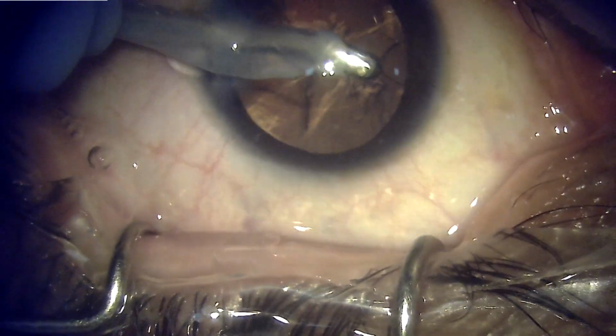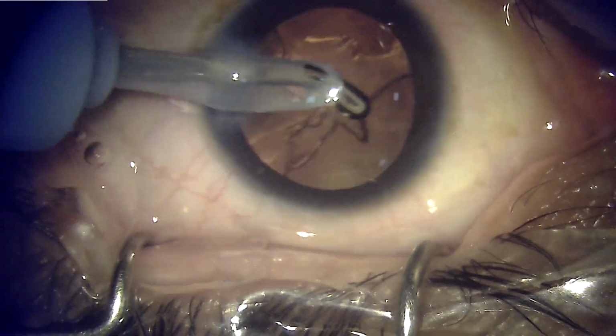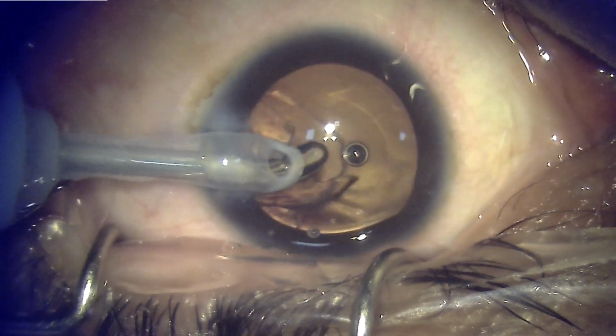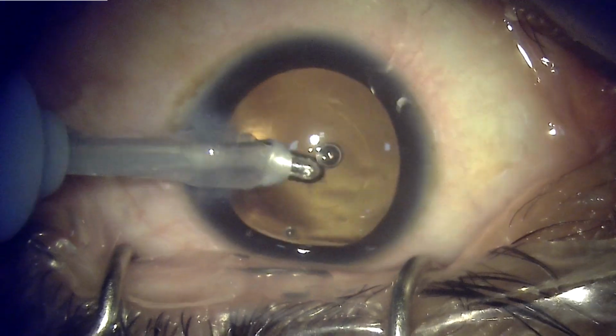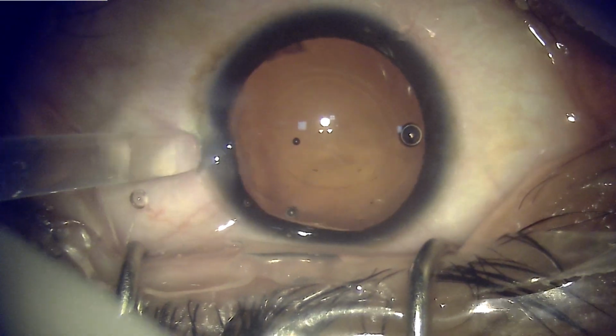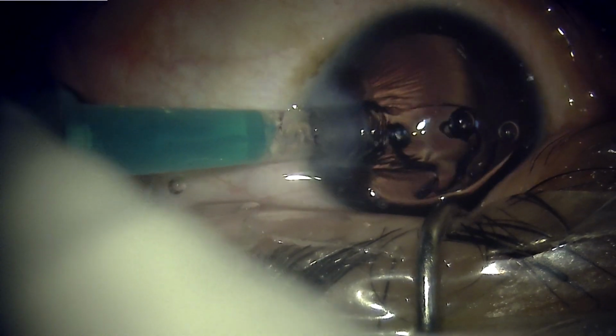So we had actually counseled the patient that you will get rid of glasses, but the vision will remain the same. That is a very safe bet because you cannot predict how the vision will be at the end of the procedure. So we have removed all the lens matter and now goes in the hydrophilic monofocal meniscus lens of minus 9 diopters.